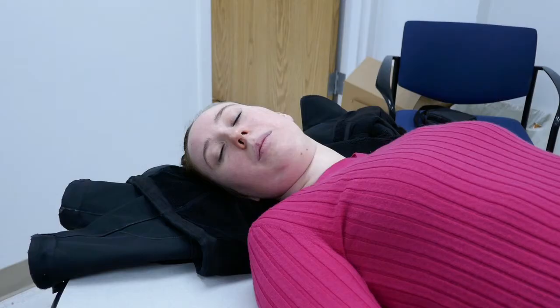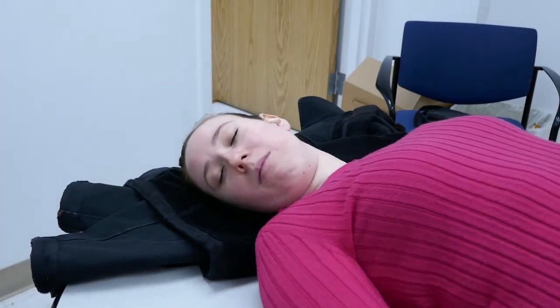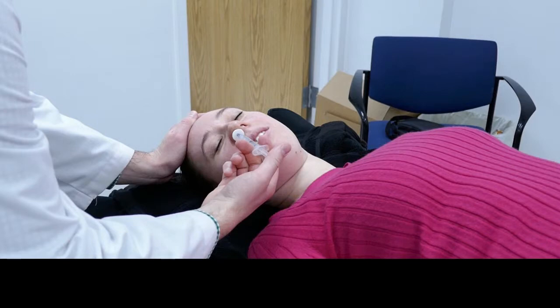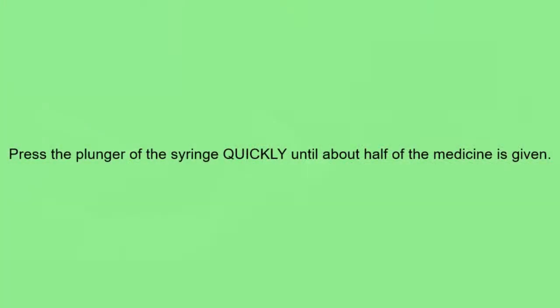If the person's nose is runny, gently wipe it with a tissue. Carefully insert the nasal adapter into one of the person's nostrils until it is a snug fit. Press the plunger of the syringe until about half of the medicine has been given.